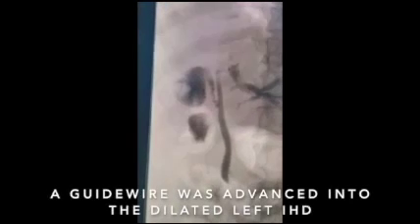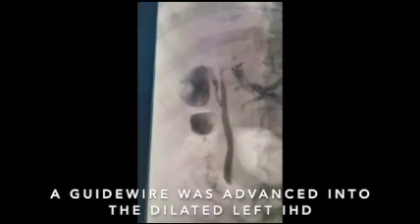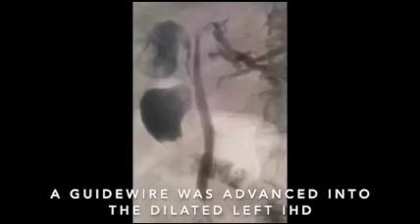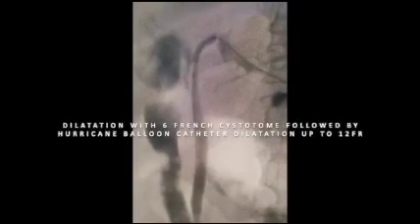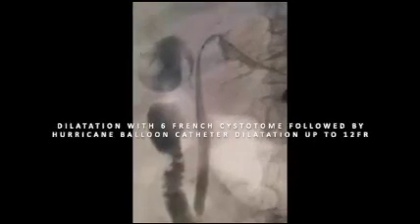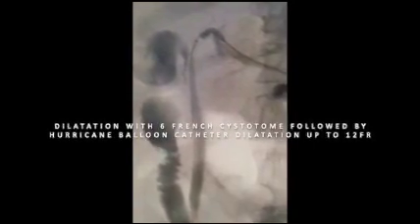Guide wire was then advanced into the dilated left intrahepatic duct and successfully traversed the stricture. After this, dilatation with a 6 French cystotome followed by a hurricane balloon catheter dilation up to 12 French was performed at the site of the stricture.